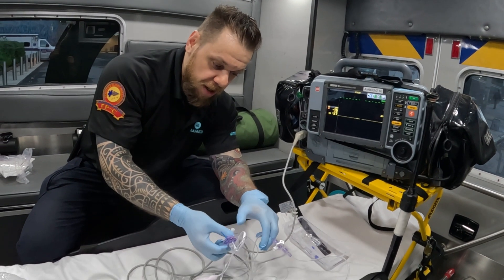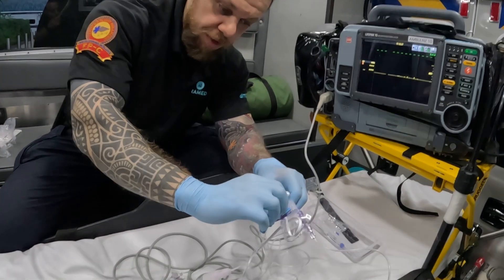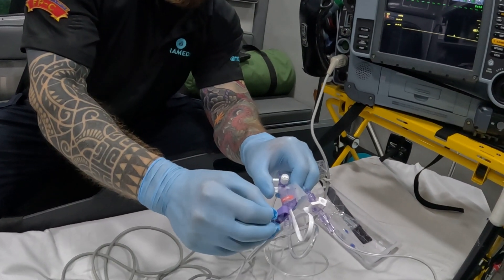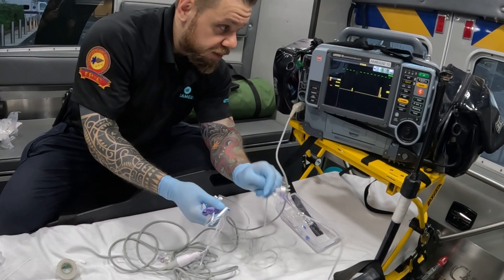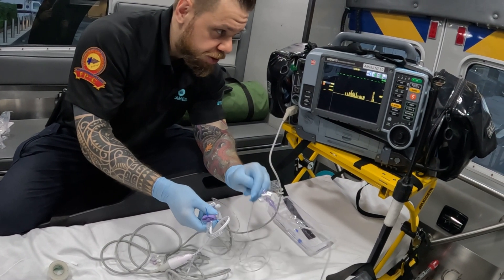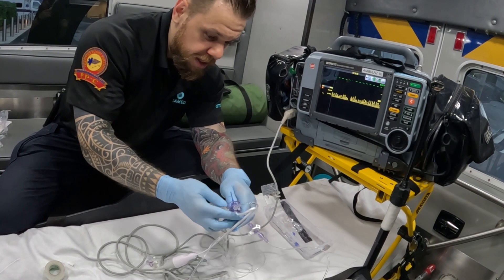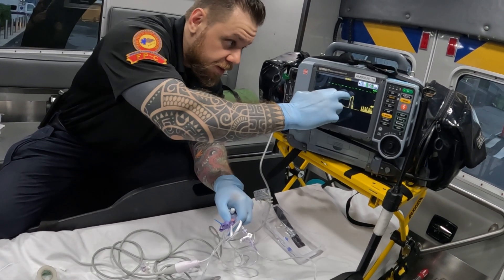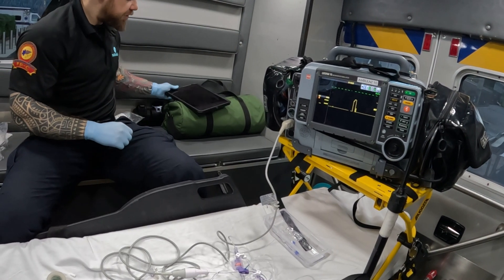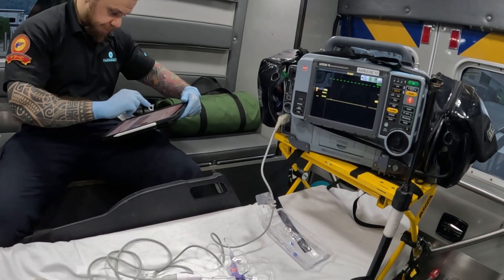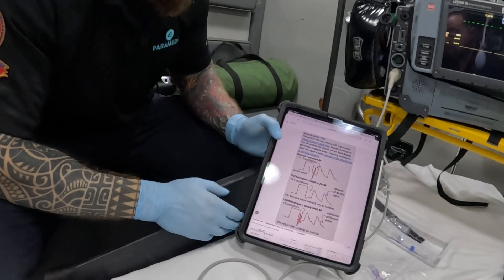One more time: once you've connected it, you're going to find your pigtail or push button and quickly snap-pull it. Blood pressure is going, and then you do a fast flush test — quickly pull the pigtail. This is called the square wave test.